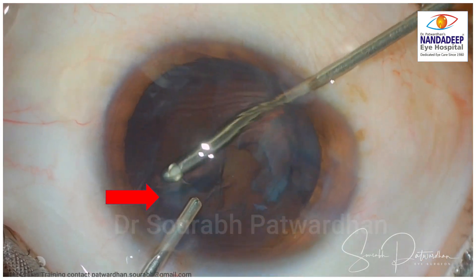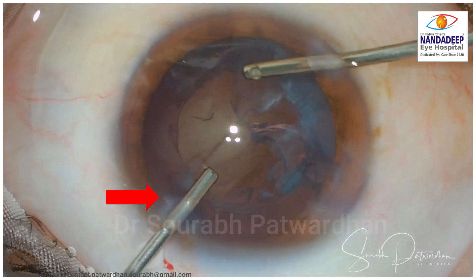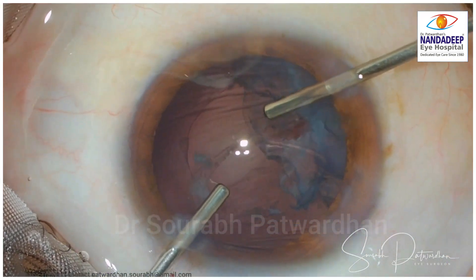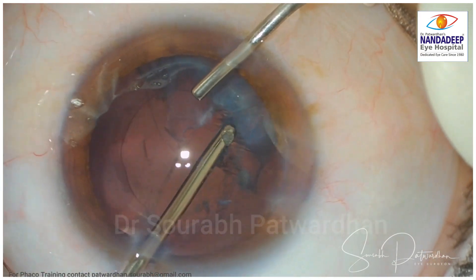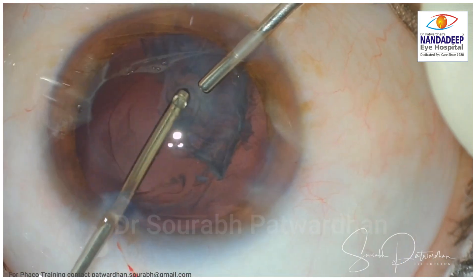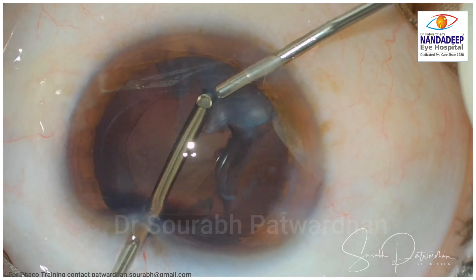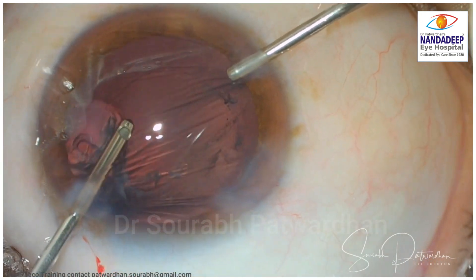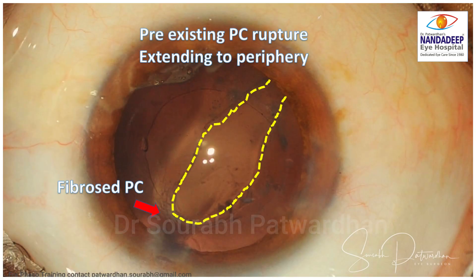Once the vitreous is cleared from the anterior chamber, we aspirate the cortex. What I am pointing to is the fibrosed edge of the PC tear, which indicates it was a pre-existing tear — you see fibrosis which would not be present in a fresh PC tear caused during the procedure. The PC rupture happened because of the blunt trauma, then the PC got fibrosed, and now it opened up as I removed the cataract. When taking out the cortex and toggling between IA and vitreous cutting mode, make sure you take everything out in one piece, because small pieces may just drop down. There is a fibrosed PC and pre-existing PC rupture which has now extended to the periphery.